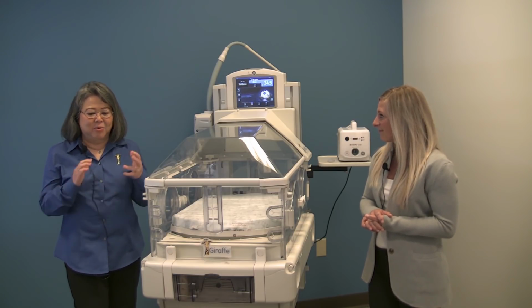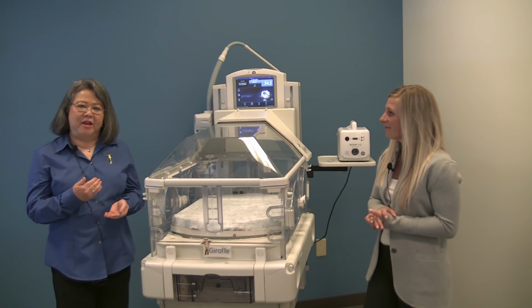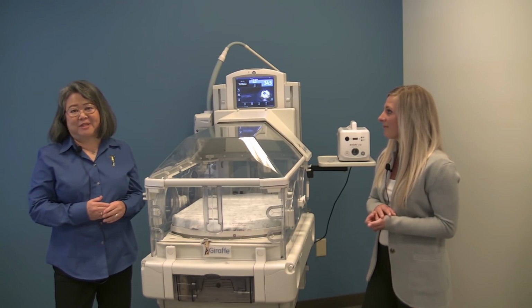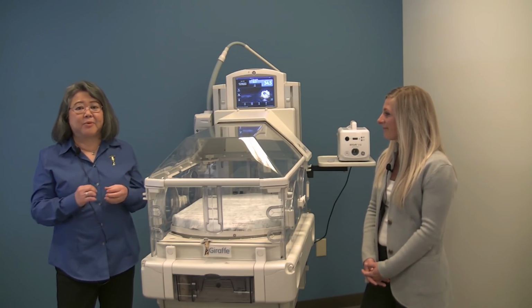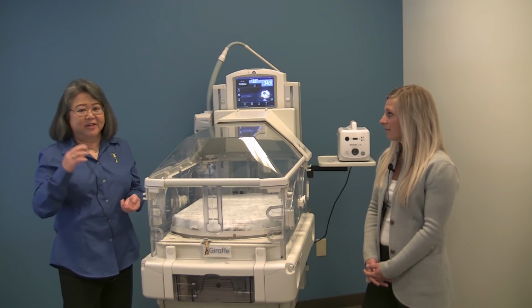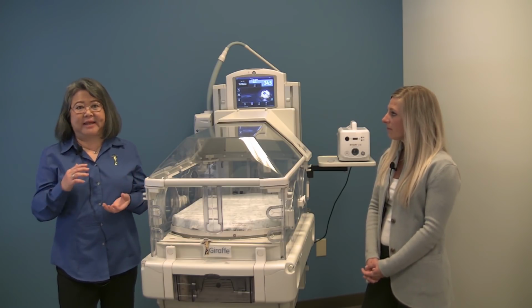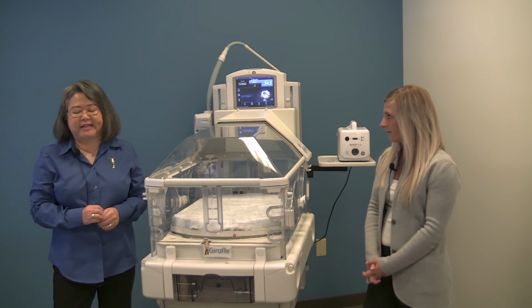And in my little world of nursing, I've seen phototherapy go from white light with fluorescent lights and tubes of fluorescent lights with banks of lights. And then there was a time we started having blue lights, and then because that was making everybody sick, we started doing blue and white on those banks. And then eventually there was a spotlight that was a halogen light source, and that was giving out a lot of heat. And people would use it as exam lights as well because it's a great light source, and you're tripping over all these devices.